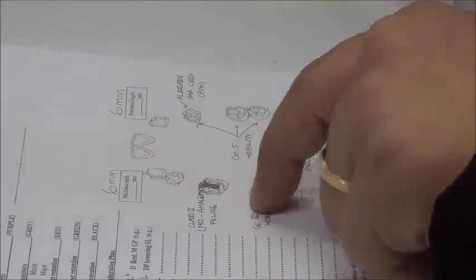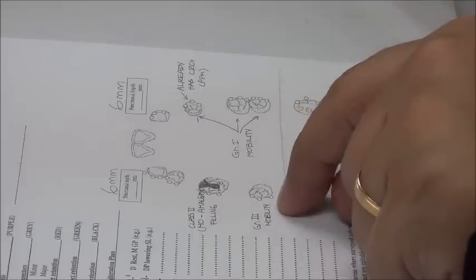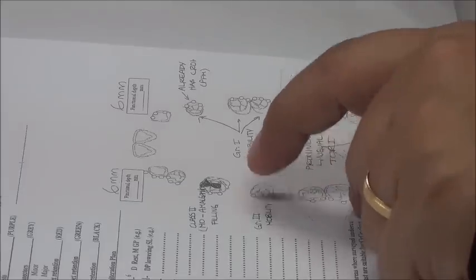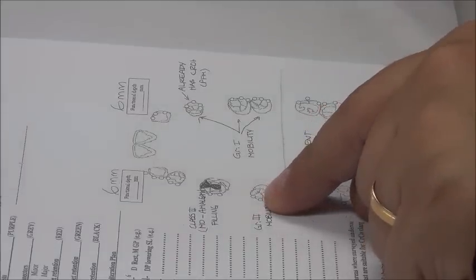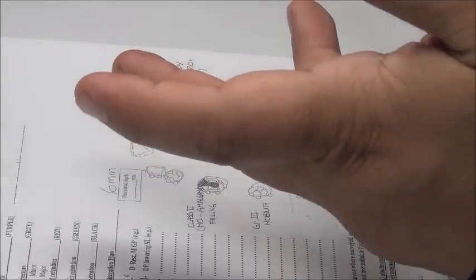Again, the case as it is is class 3 mod 5, right? As it is. The first condition I put is that the molar has grade 3 mobility. That means plan for extraction. That means I have a saddle area now here. It became class 2 mod 5. Okay? Now if I say the lower 7 is also not present, am I going to replace the 7? No.